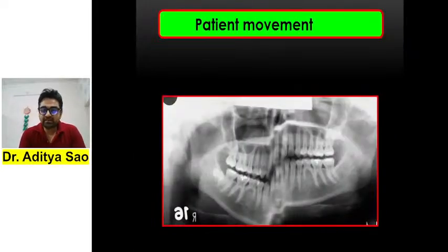Patient movement, this is very easy. If something like this comes up, then great. Okay, everyone will score points.